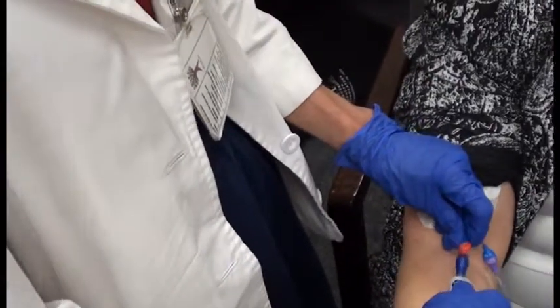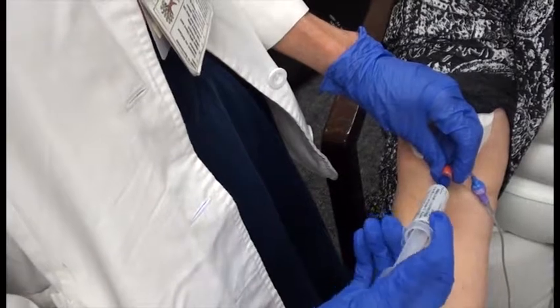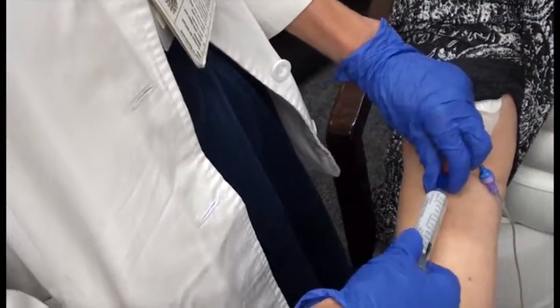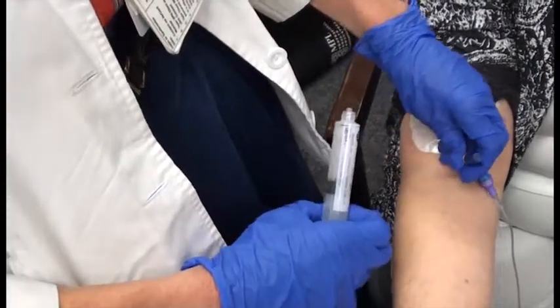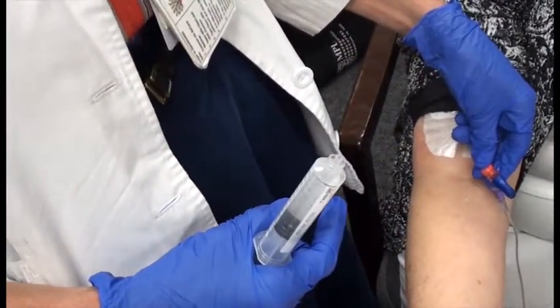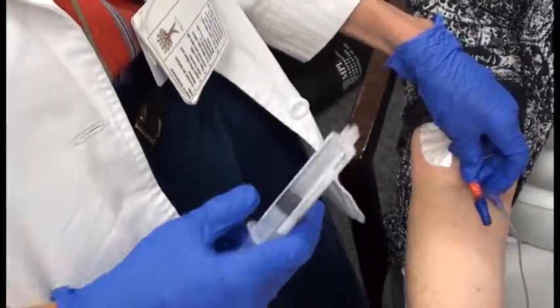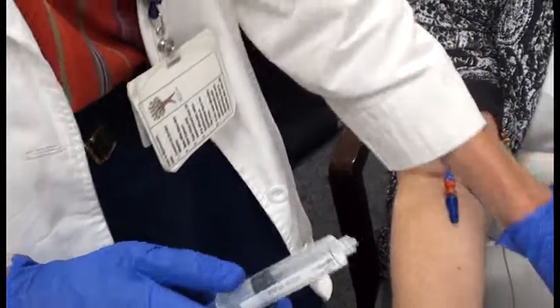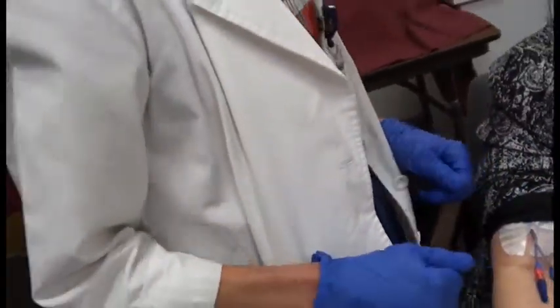So perfectly dry, and then you're ready for your second flush, which you push-pause all the way down, and then your very last mL you unplug while you're flushing, and it should get just a little wet, which means you put positive pressure in that cap, which will keep it from clotting, keep blood cells from collecting on the tip. So preventative push-pause and positive pressure flush at the end.